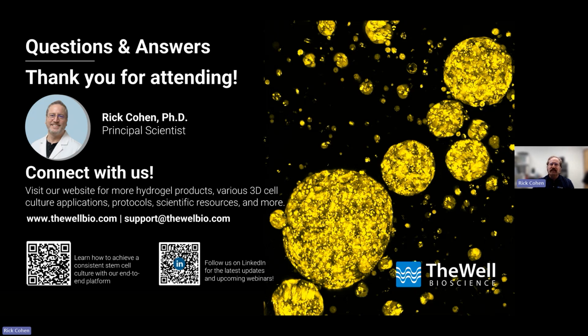But what we're doing is designing a kit that would support things more optimally, which means, to go to the floor plate, we're going to be using our neural stem cell basal medium and our neural stem cell supplement, but create a tailored floor plate cytokine addition. So I don't know if that answers the question, but in a similar manner, use a very similar input for the neural stem cell or floor plate to mature neurons.